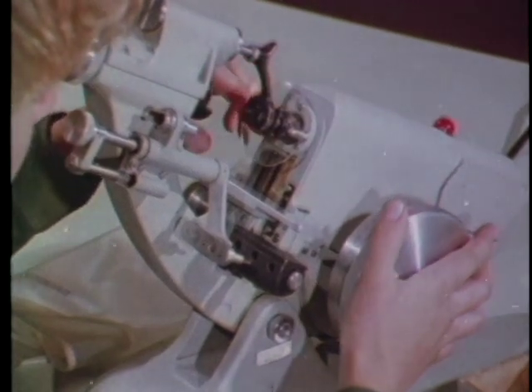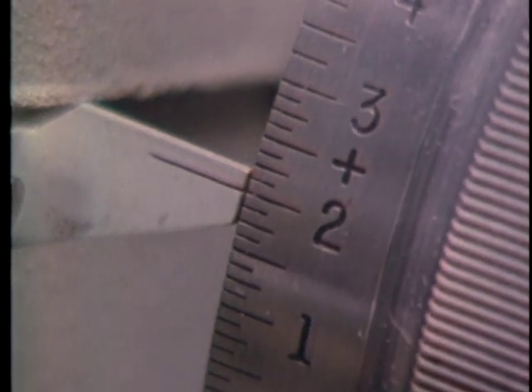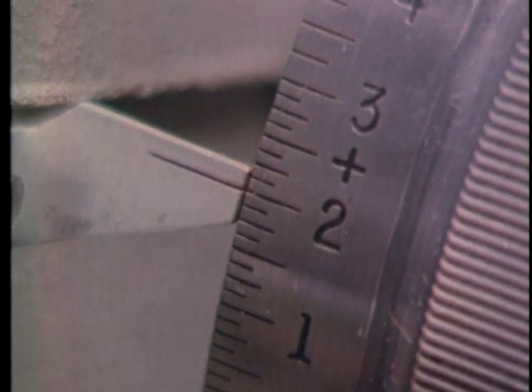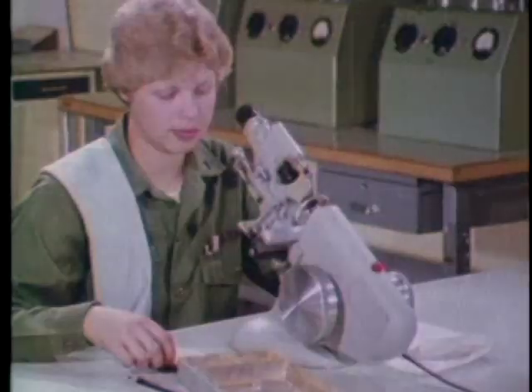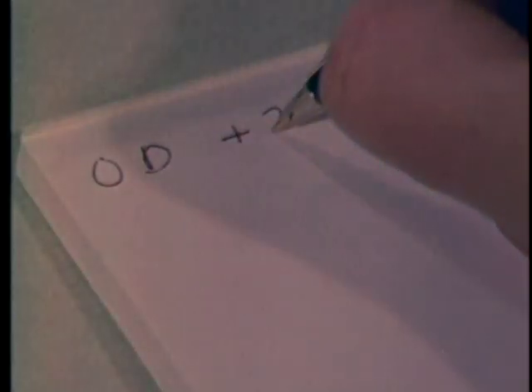Neutralize the lens by turning the power wheel until the target lines are sharply focused. Is this a plus reading or a minus? Plus. Remember that the black numbers mean plus. In school you write down your power wheel reading; in an optical lab you would check the reading against the prescription.